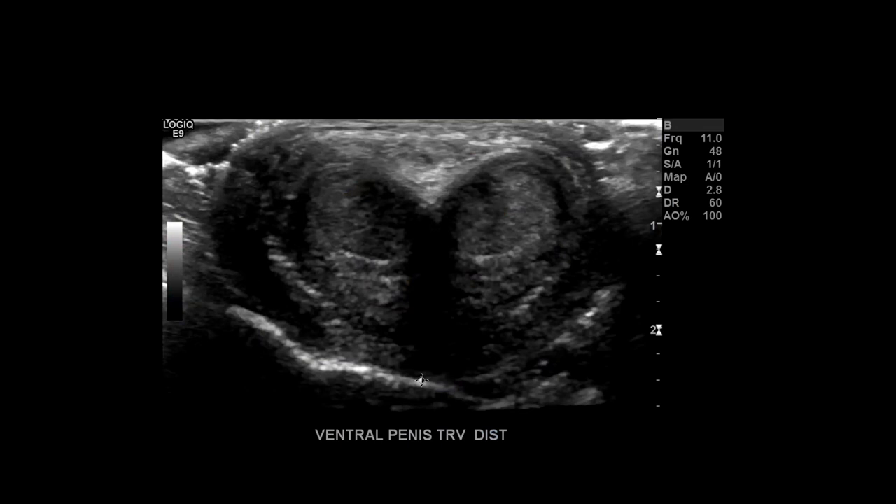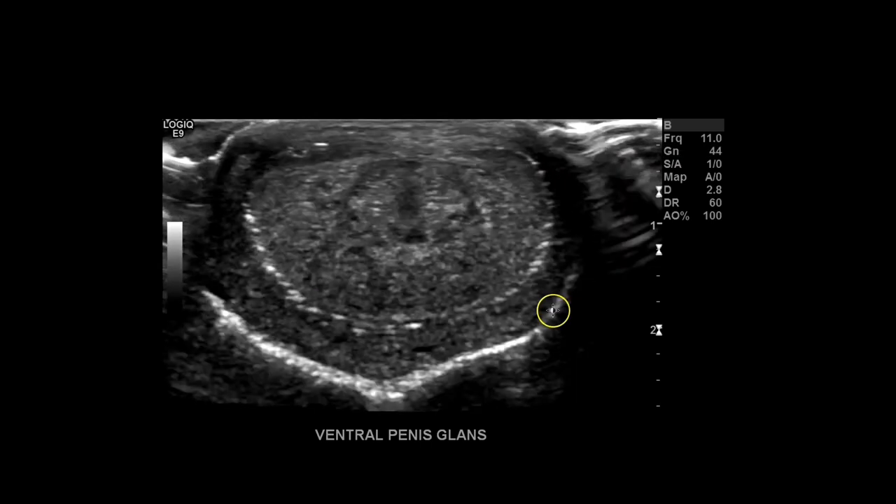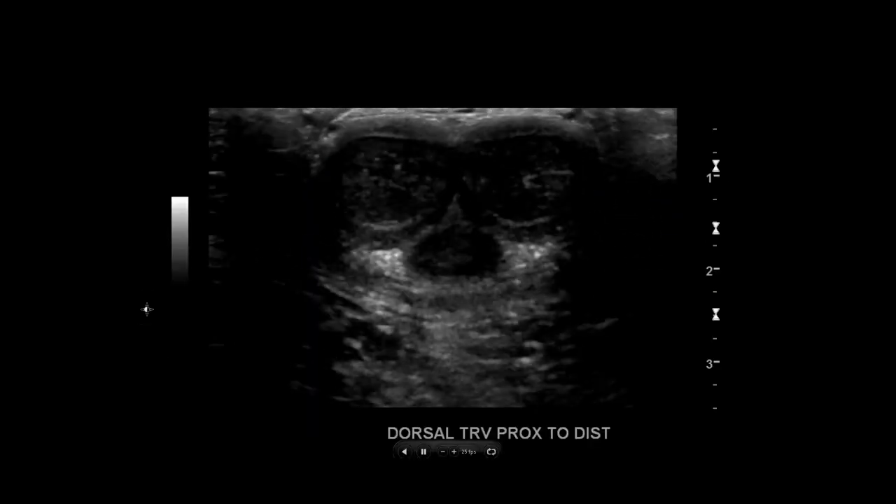Distal is right before it reaches the glans — corpus spongiosum here, corpus cavernosum on either side. Then all the way distally to the glans, you can see the urethra terminating in the meatus. The echogenic dots represent air under the foreskin; if you're scanning a circumcised patient you won't see that. Add color doppler, and that's it. One quick cine loop from proximal to distal and you're done.